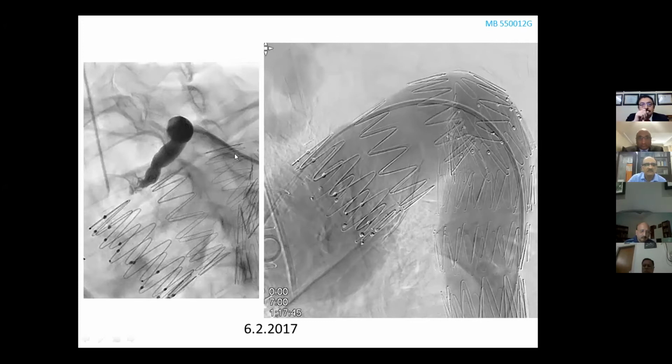So we thought we could try and make a perforation in the graft and come through that perforation to get access from above. So this is a brachial angiogram, but then we actually punctured the left subclavian artery, supraclavicular puncture, and tried to get a Brockenbrough needle to break through this. But because of this angulation, it just kept slipping down. And we didn't have RF ablation with us.